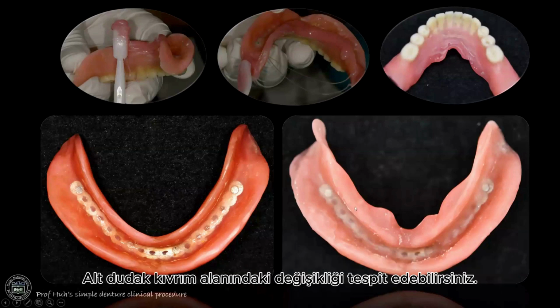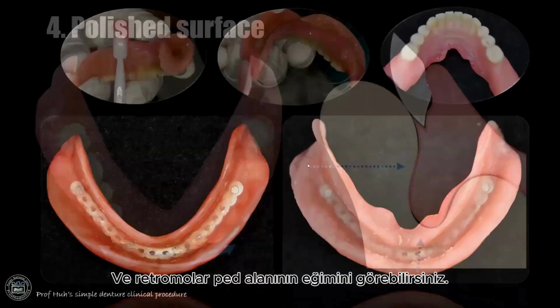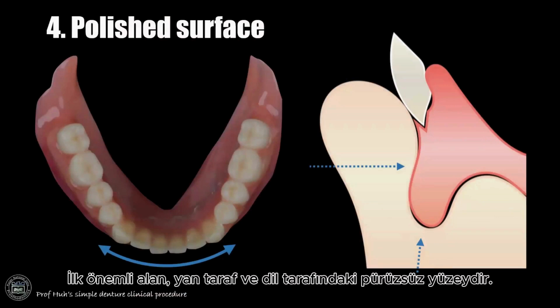So you can detect the change of the sublingual fold area, and you can see the curvature of the retromolar pad area, okay? The first important area is the polished surface in the buccal aspect and lingual aspect.